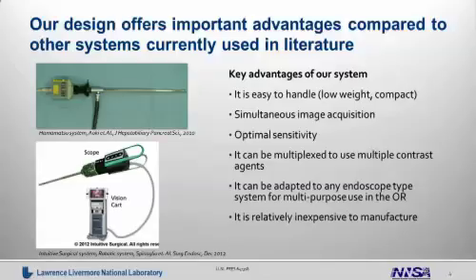This is a system that is different to what has been shown in the literature in recent years or is commercially available. The system on the lower side here is a robotic system, and really our technology does not try to cover this area. Our technology is actually trying to cover the area where the system is adapted to existing endoscopes, and it becomes less expensive and more flexible.